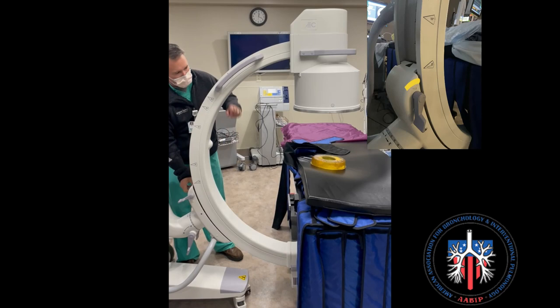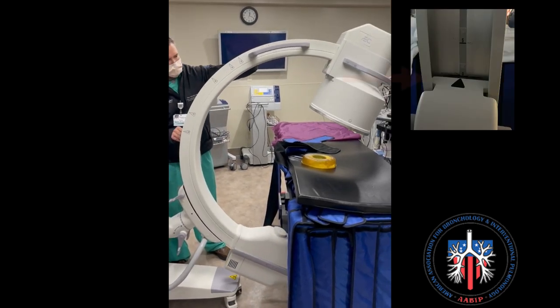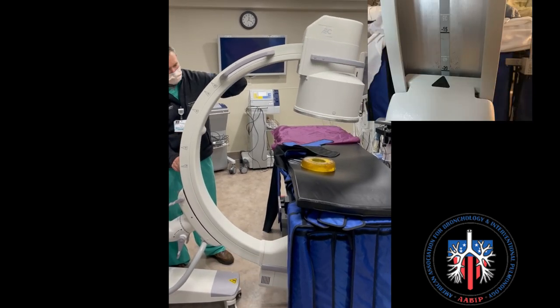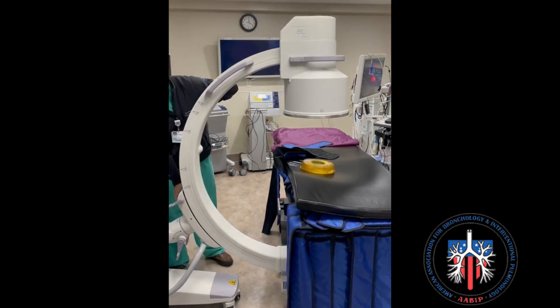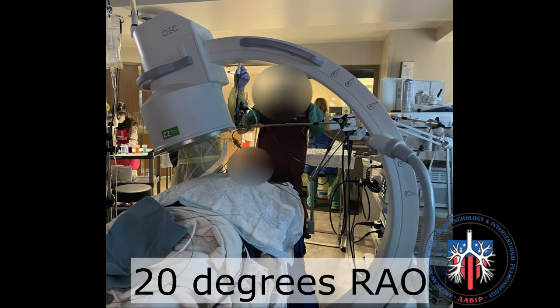To move the C-Arm laterally left or right, release the lever shown here. The C-Arm is set at 0 degrees. You can then move the C-Arm to the desired position from 0 degrees. Lock the C-Arm once the desired position is found. Here the C-Arm is positioned at 20 degrees RAO.